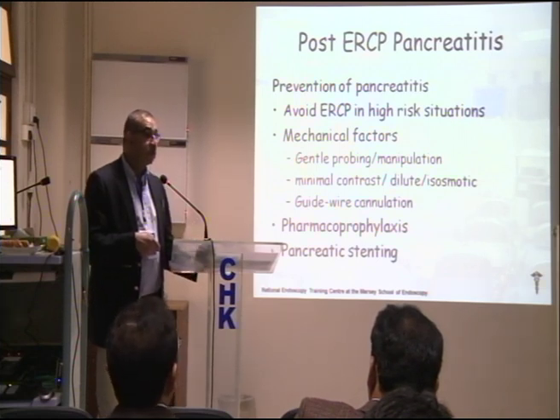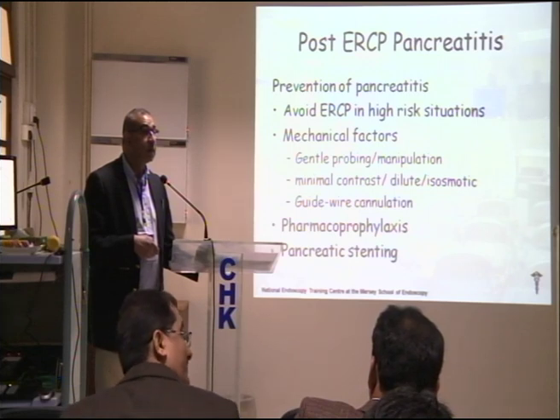Minimum attempt, like 3? Pardon? Minimum attempts to the pancreatic duct before putting in the stent?